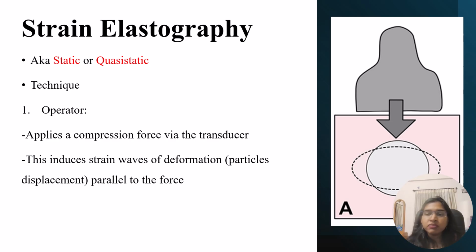But the biggest problem with strain elastography comes here, that the operator has no control over how much tissue is compressed by the ultrasonic transducer. तो ऑपरेटर के प्रेस करने से कितना टिश्यू कंप्रेस हो गया, that हम मेजर नहीं कर सकते.